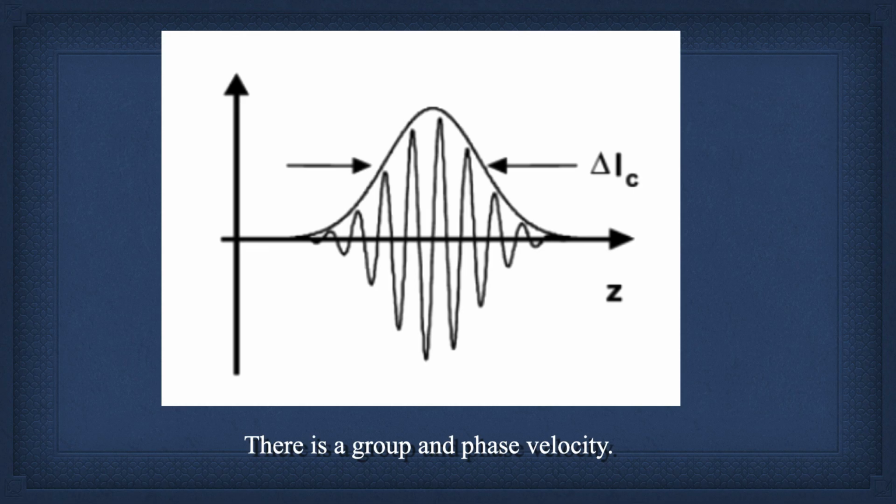So we're going to picture the light emitted from our source as being a pulse with an envelope and a carrier frequency. That carrier frequency has an envelope, and the detector can only pick up the whole envelope. It's not quick enough in most systems. I'm not talking about phase sensitive OCT, a special type of OCT, to pick up the rest of the signal.